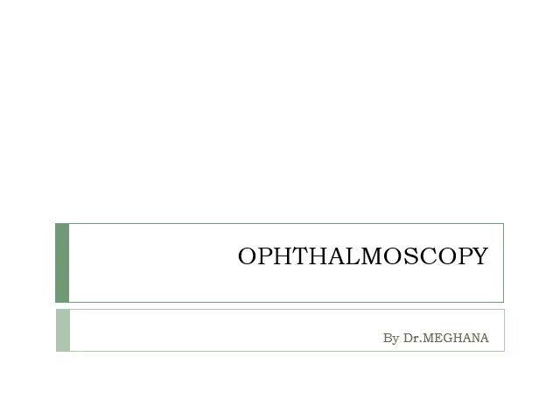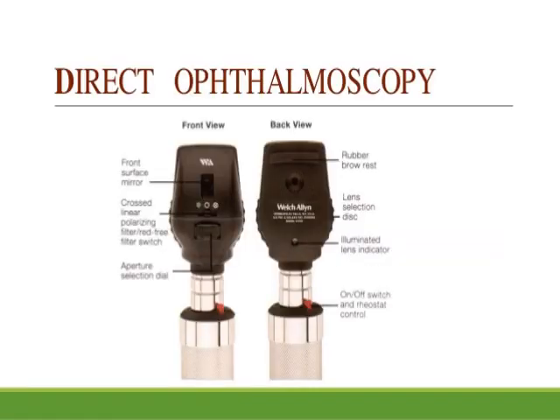Three methods of examination are used. One is distant direct ophthalmoscopy, then direct ophthalmoscopy, and indirect ophthalmoscopy. First one is the distant direct ophthalmoscopy.